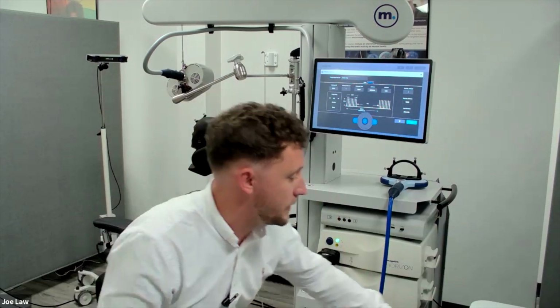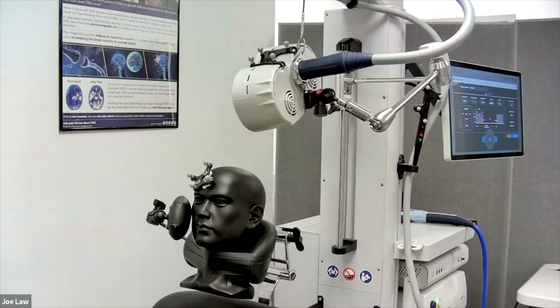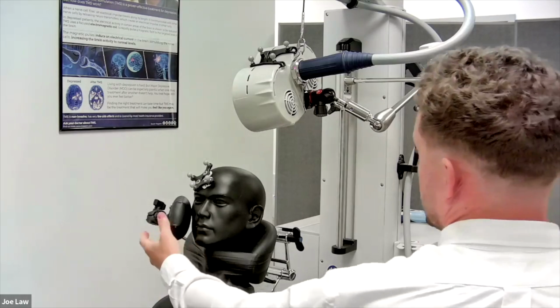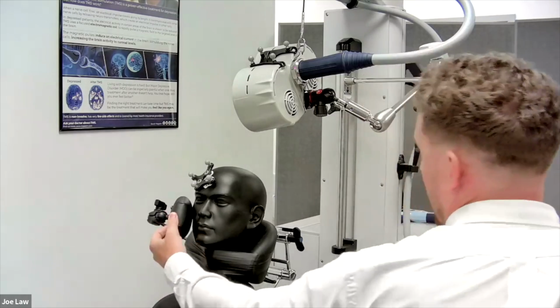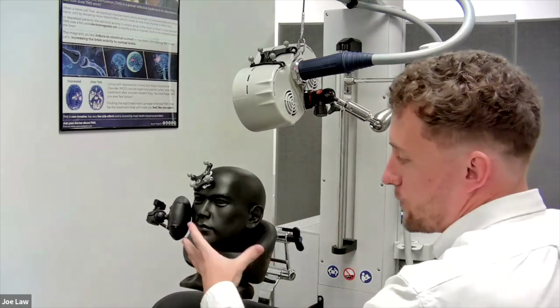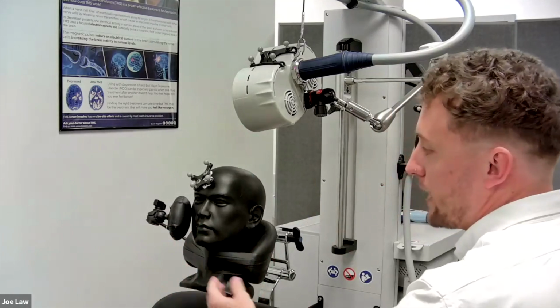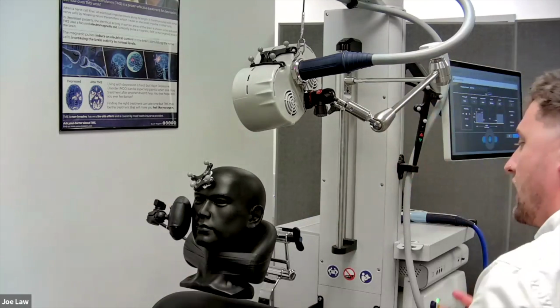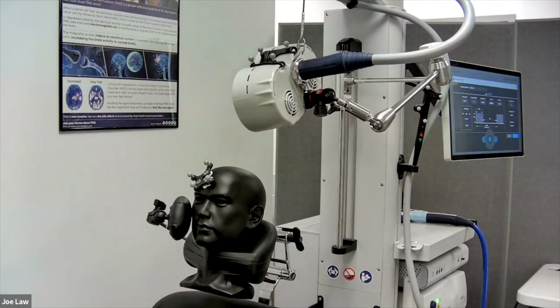It also comes with, if I switch cameras, you can see here, a cheek rest. The way this works is you gently place this against the patient's head. So when you put the coil on the patient's head here, it stops the patient from shying away and moving their head to the right-hand side. You can use that as a cheek rest or a temple rest. Again, fully adjustable on 3 ball joints.